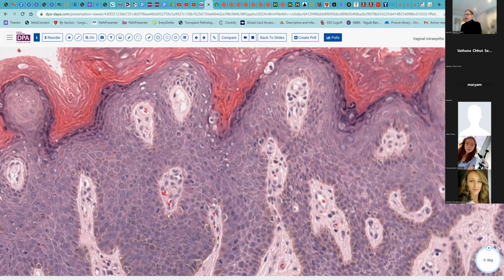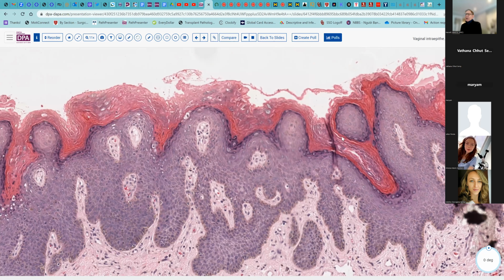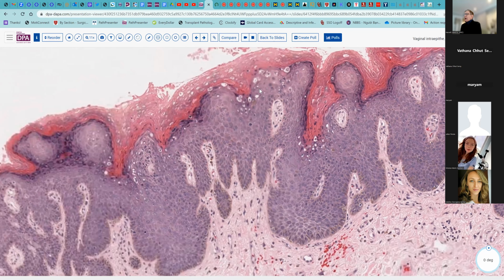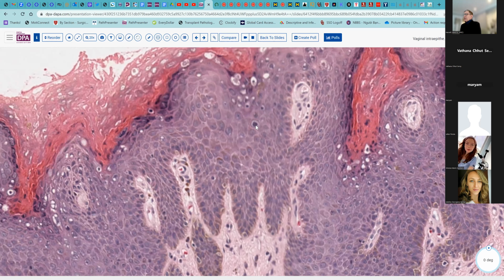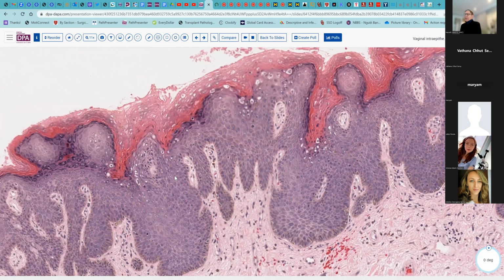We see more mitoses down at the base, more atypia. And so grading this lesion is a little bit more complicated. We go from that more purely hyperkeratotic area to this area with a pretty clear-cut dysplasia. And I think here you'll agree that this is a mitosis. So it's a mid-level mitosis, and that certainly, I think, qualifies it as a higher grade lesion.